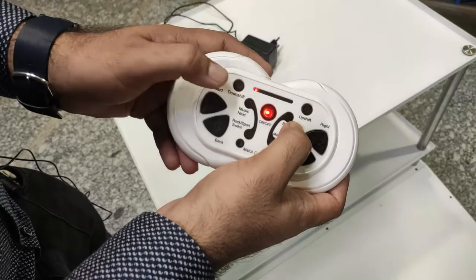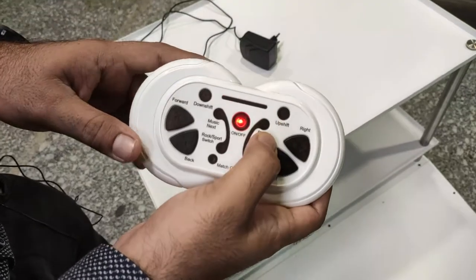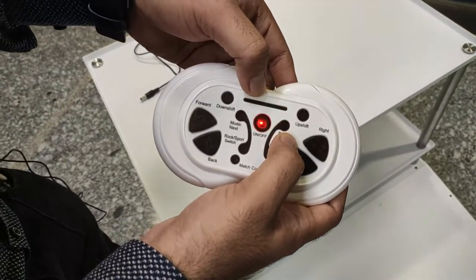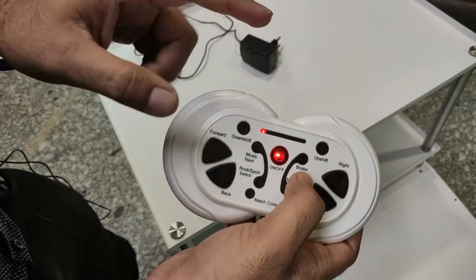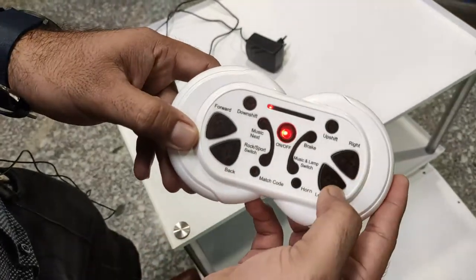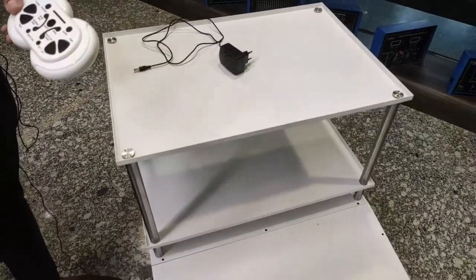By decreasing the LED lights, the speed is decreased. This is the brake button — when we press the brake one time, the speed indicators are blinking, which means the cart is now in brake position. When we press the brake again, the cart is ready to run. These are the forward, backward, right, and left turn buttons for moving the cart.